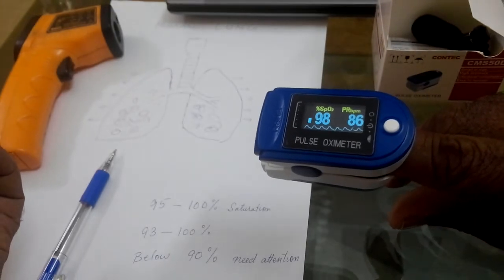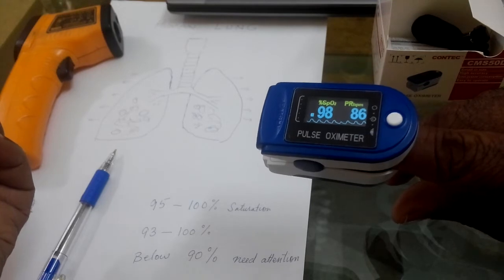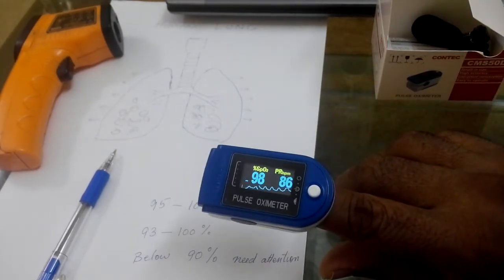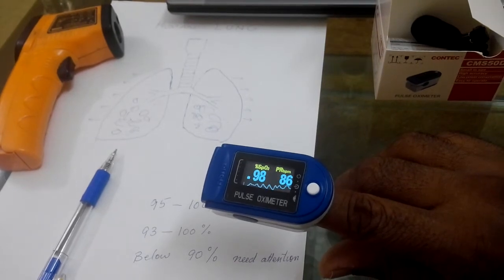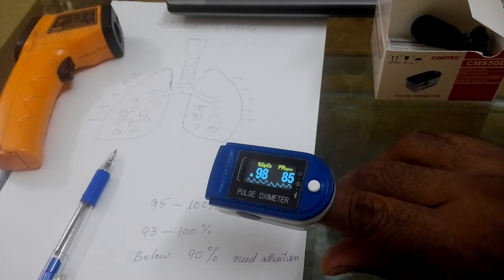So what I will do is stop my breath for a few seconds and check whether these digits are changing or not. I'm controlling my breath for a few seconds.